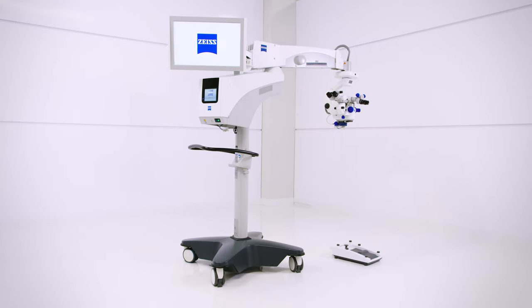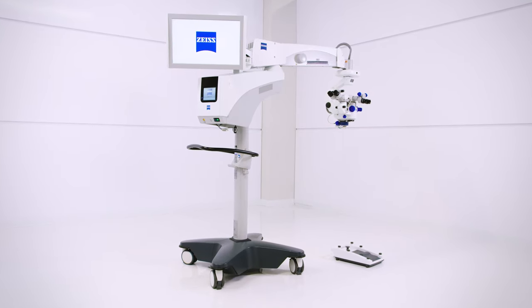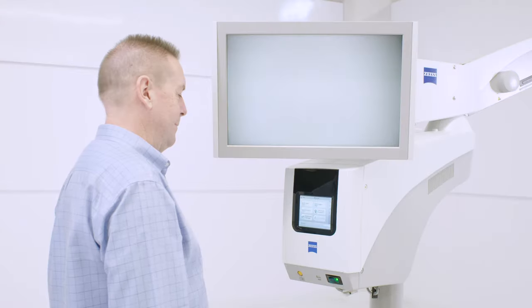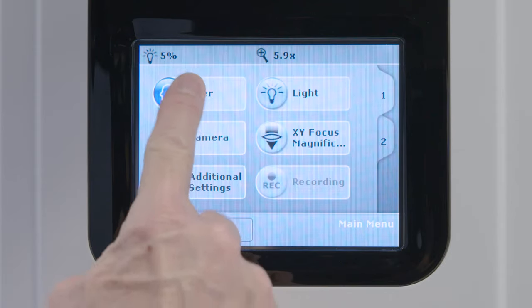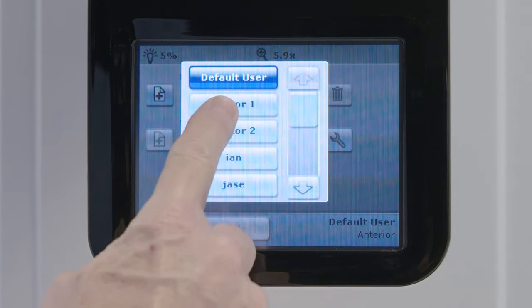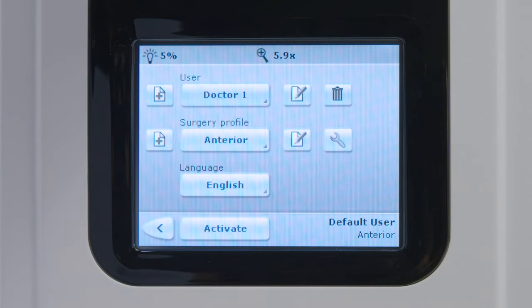The Opme Lumera 700 from Zeiss allows you to set foot control preferences for each user and each surgical profile. From the main touchscreen, select the user icon and then select the user icon again on the second screen. Select the name of the user you would like to configure. Once the user is selected, the user icon will show their name.